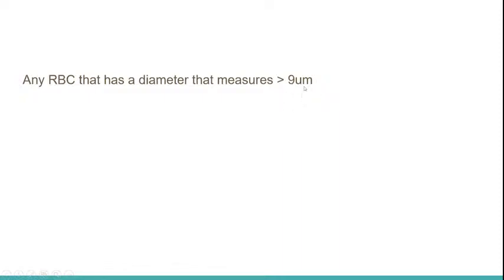Okay, so yeah, MCV is still the best. But again, confirmation in this slide is still important, just to confirm what the analyzer saw in the sample.